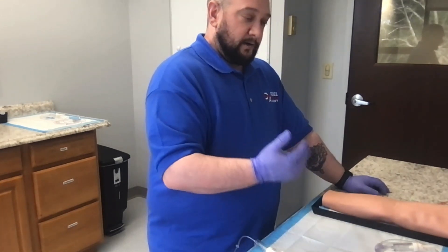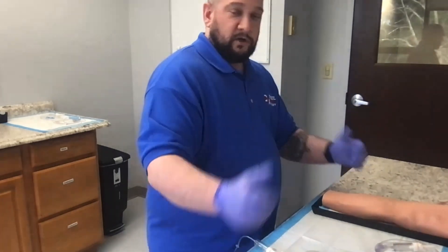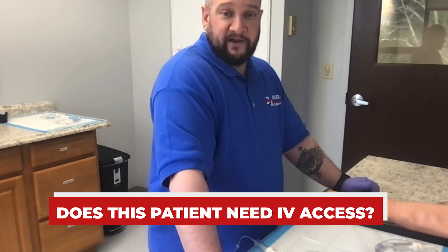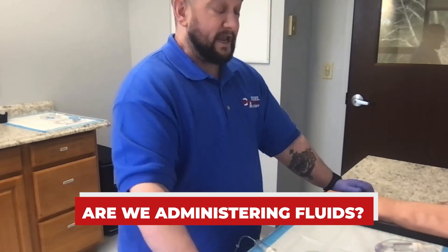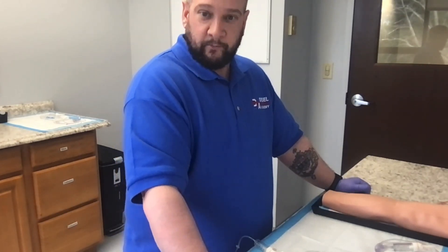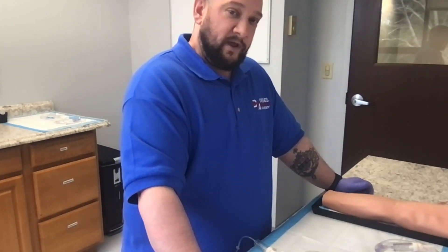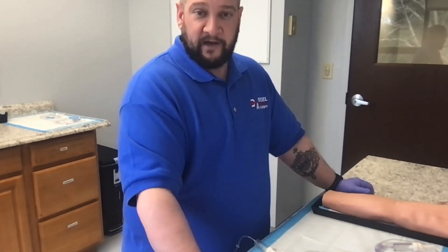Once you've done your assessment and made a determination — does this patient need IV access, and are we administering fluids? If we're giving cardiac medications, we'd prefer to have fluids running rather than a lock. If the patient decompensates, you don't want to be backtracking to spike a bag. You always want to be two steps ahead of your patient.